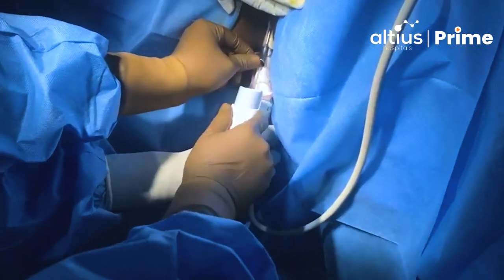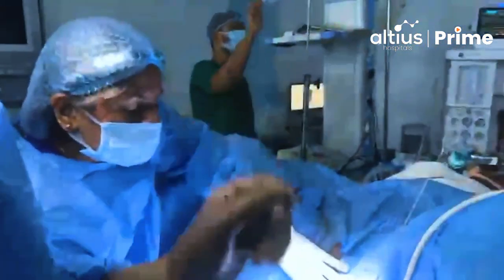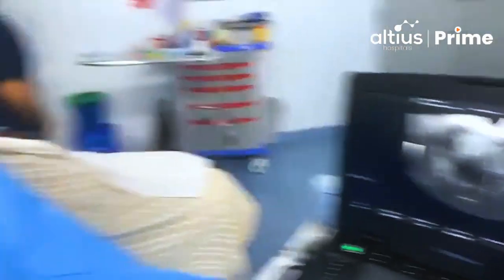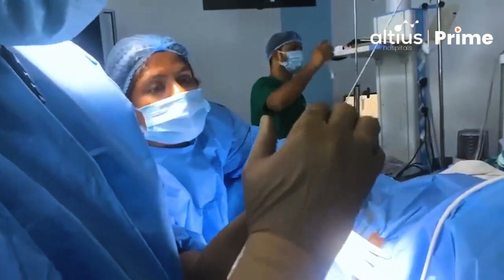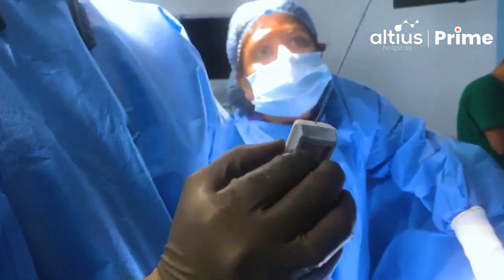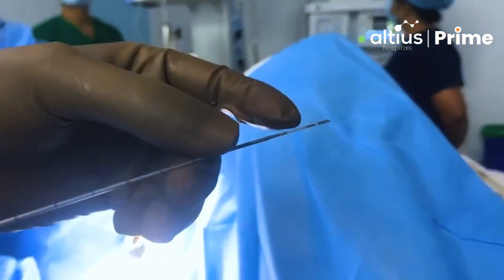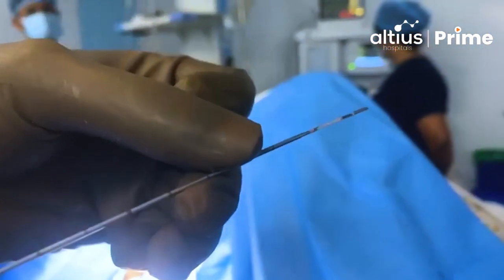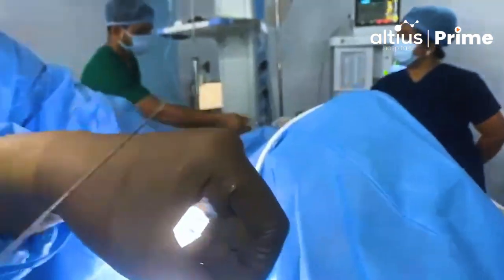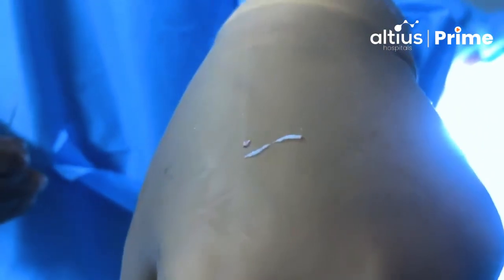It gives some resistance. To obtain the tissue we should be very careful — we should not push both buttons down; only the button for the sheath has to be pushed. In the groove demonstrated previously, we can see there is some tissue within. This is a strand of tissue we obtained from the mass region. This is the target sample — one can see this nice strand of tissue obtained from the sample.